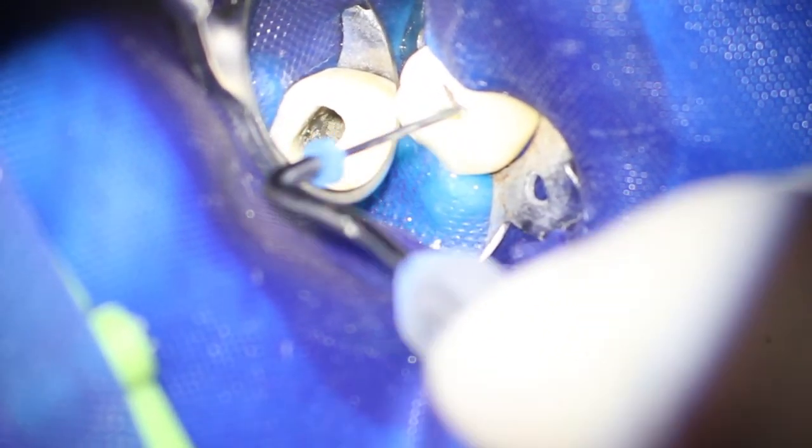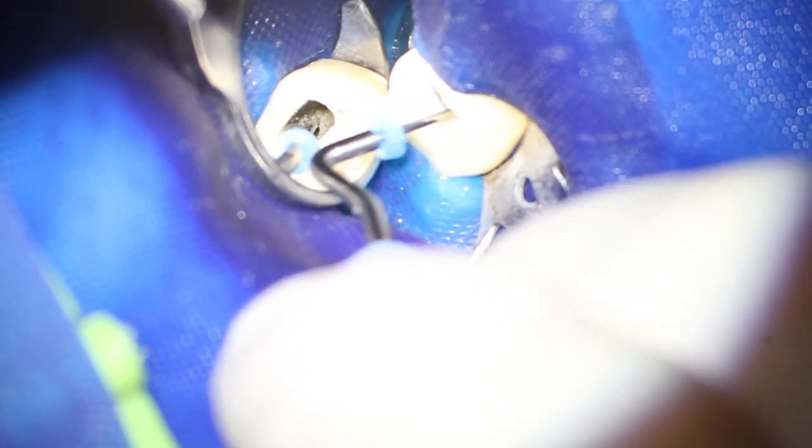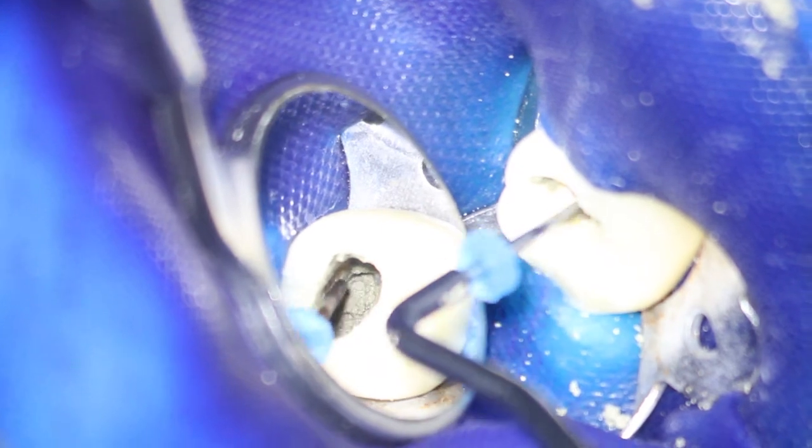With your plugger you insert MTA into the canal and then you use your ultrasound scaler and deliver the energy to the handle of your plugger. And you can see what happens. The quite dry MTA becomes more fluid and you can easily compact it into the canal space.